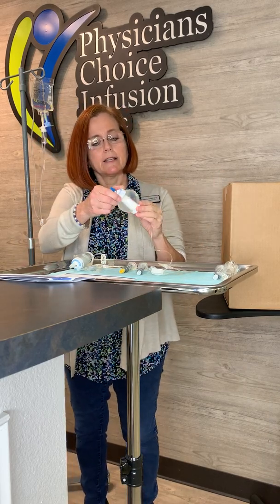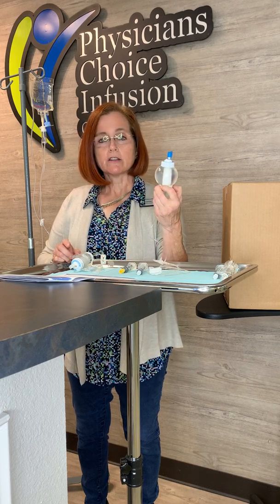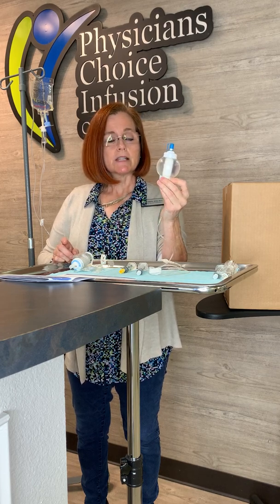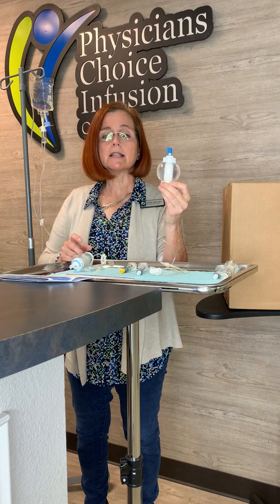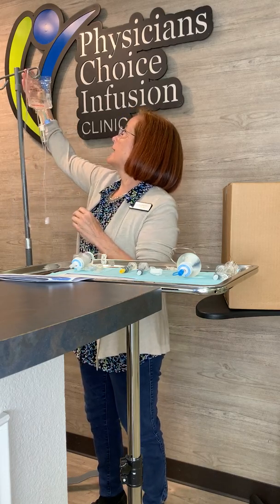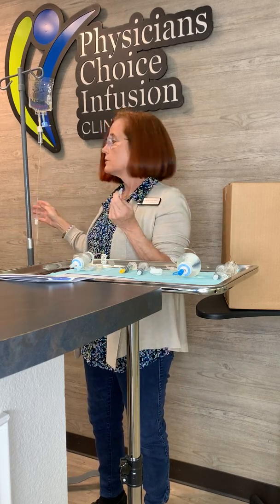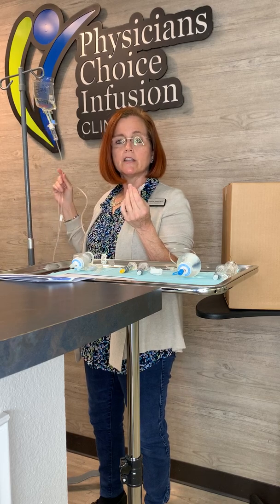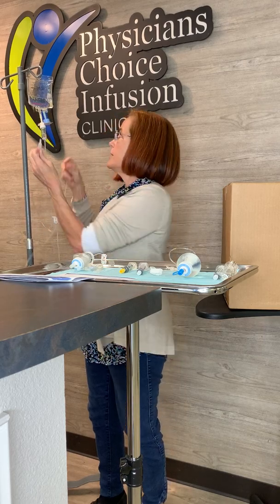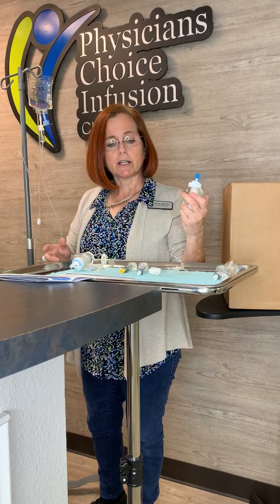We're going to discuss the devices that can be used to infuse your medication. This device here is called an elastomeric device or a grenade. It's a pressurized little infusion ball that your medicine will flow in — it's pressurized so it does not need an IV pole. The other device is your regular IV bag. You will get a disposable IV pole with your supplies if your medication comes in an IV bag. You'll hook it up and then you'll be able to put it on the pole and walk around your house. Most of our infusions come in the elastomeric device. Once you hook this up, you can put it in your pocket and walk around your house.